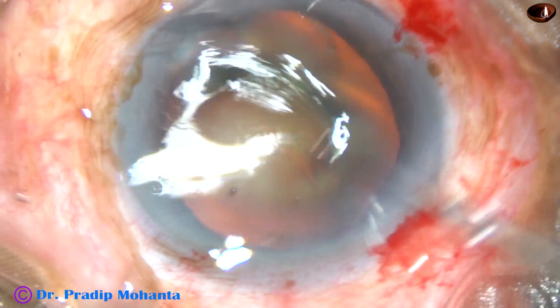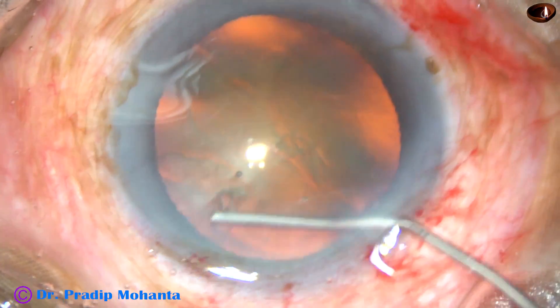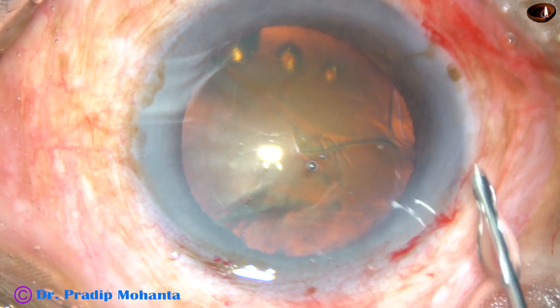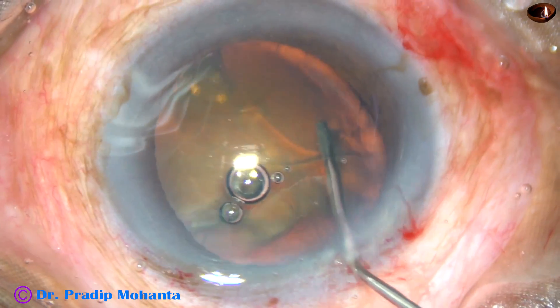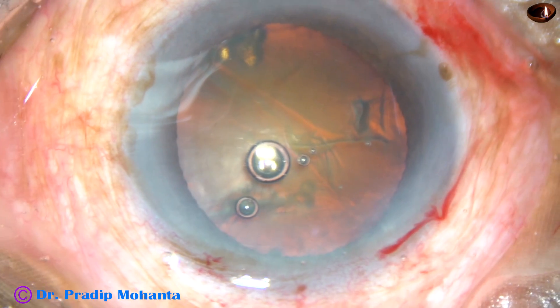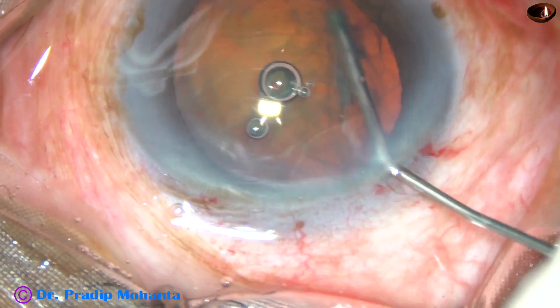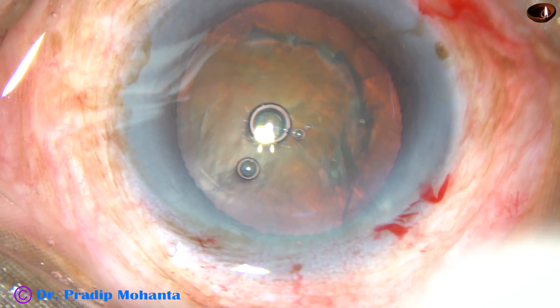Now hydrodissection. Fluid wave is passed just underneath the anterior capsular rim. In this case, some air bubble also went in. And as I rotate the nucleus, the air bubbles come up.